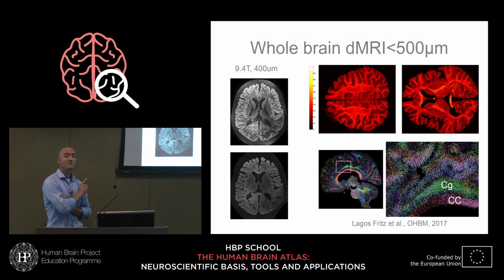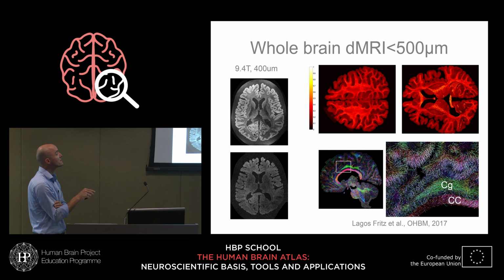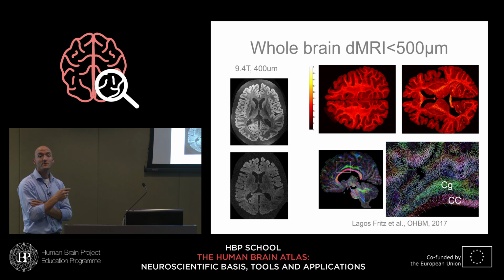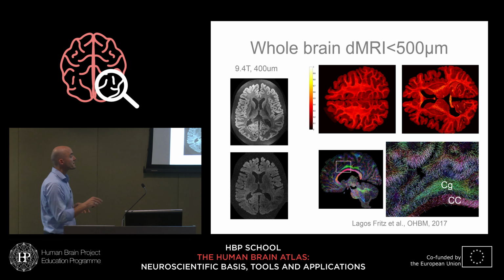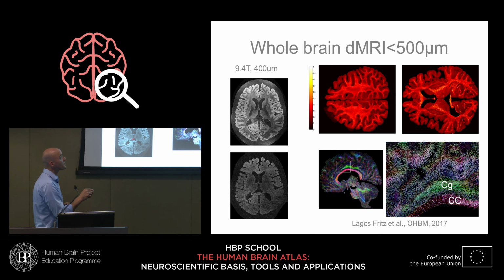And now here we're doing diffusion imaging at that resolution, and you can see that indeed in the low diffusion weighted or zero weighted imaging, you have the resolution and the contrast, or even better, than what you're used to in vivo anatomy. And we can now do diffusion with this. This is the diffusion weighted data. A single volume will look very noisy, but of course analysis goes over many such volumes.